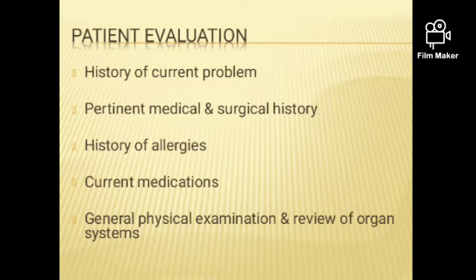Next, when you are doing the pre-procedure evaluation, you have to evaluate the history of the current problem, any medical history or surgery, history of allergy and current medications, and also review of certain follow-up investigations like chest x-ray, CBC films, and ECG reports.